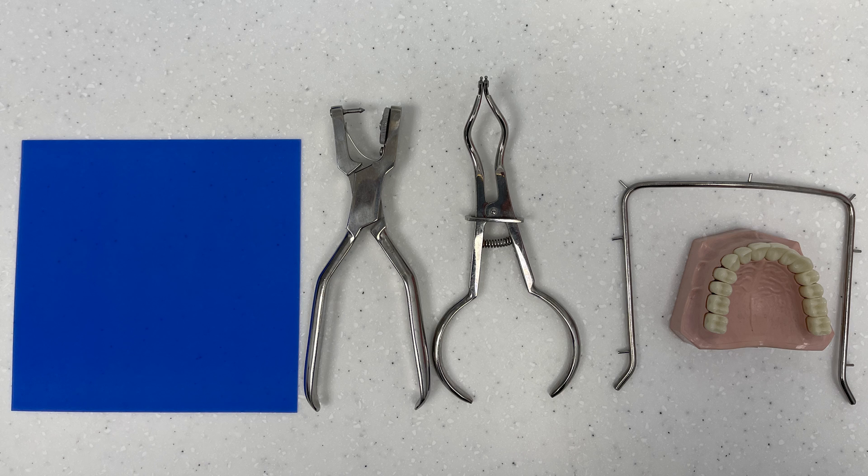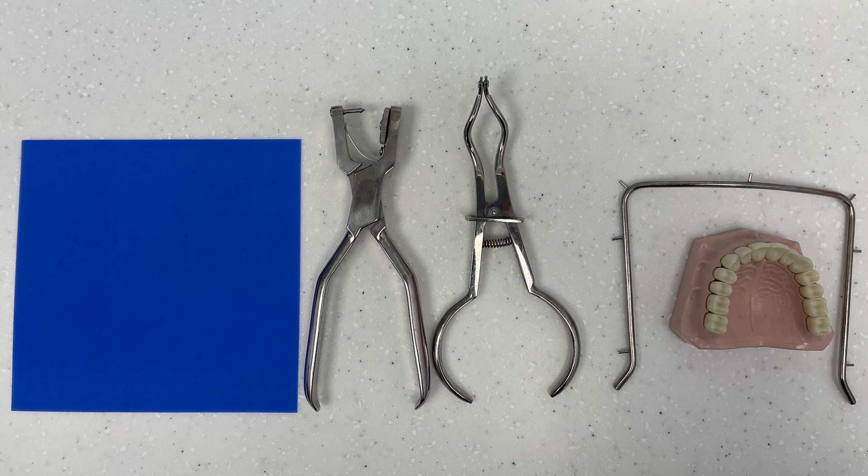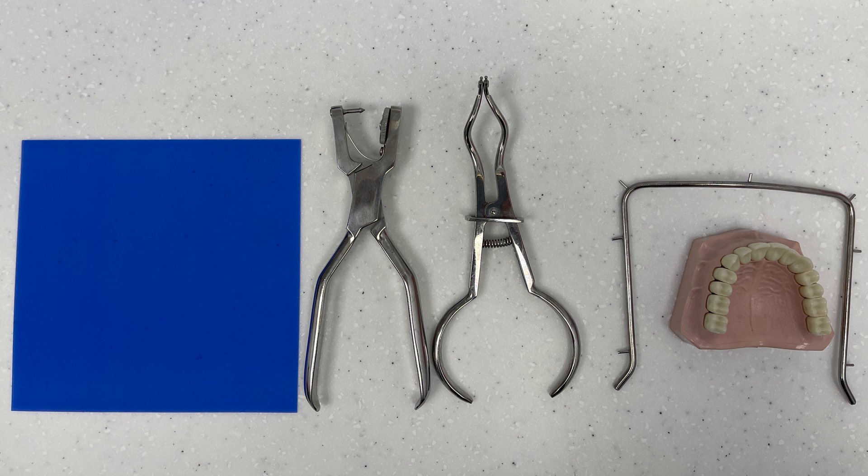Another technique is to do a hot test on a tooth. In the olden days they used to use a hot GP to do this, but we don't really do that anymore. An easy way to do the hot test now is to use a rubber dam sheet and some hot water.